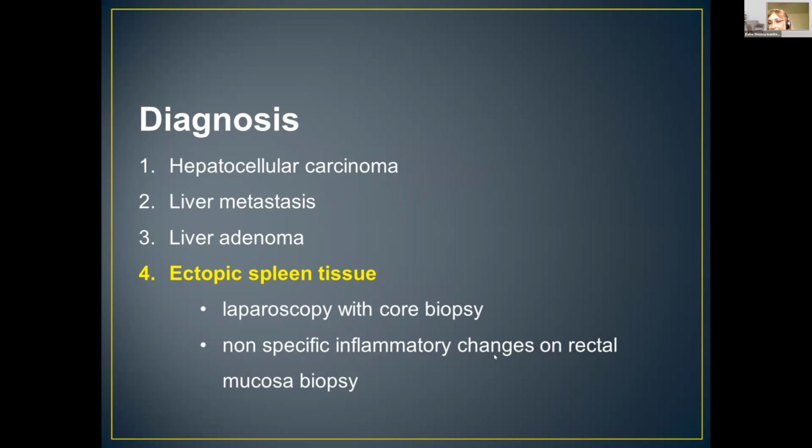About the enhancement of the splenic lesion, I want to point out that for CEUS in spleen, the contrast agent dose is half of the liver dose.